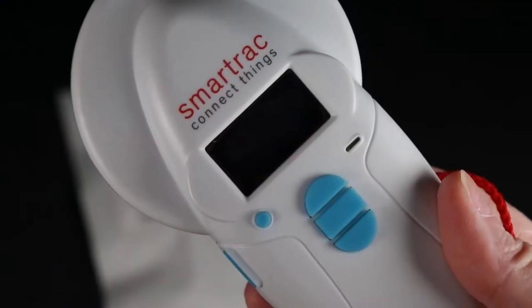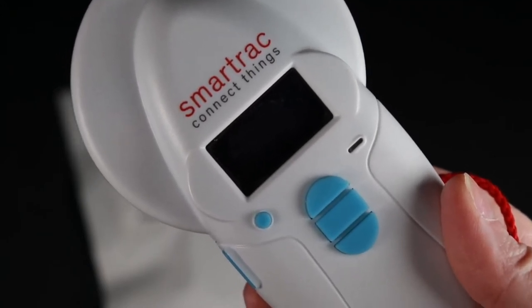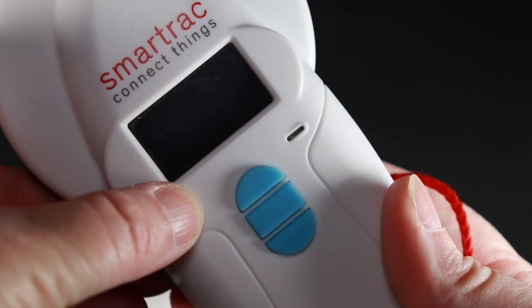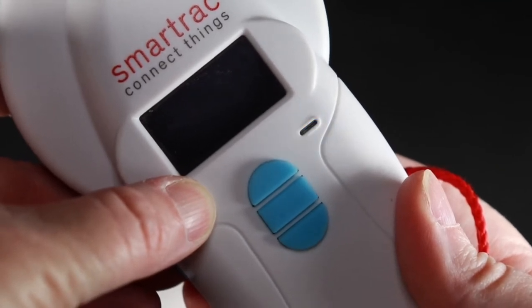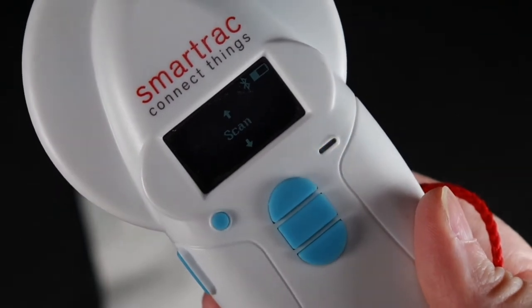Hello. In this video I'm going to be demonstrating how to do microchipping on your kittens at home. I'm using a Smartrac Connect Things microchip scanner. I'm going to power on the reader so that it's ready to read the microchip.